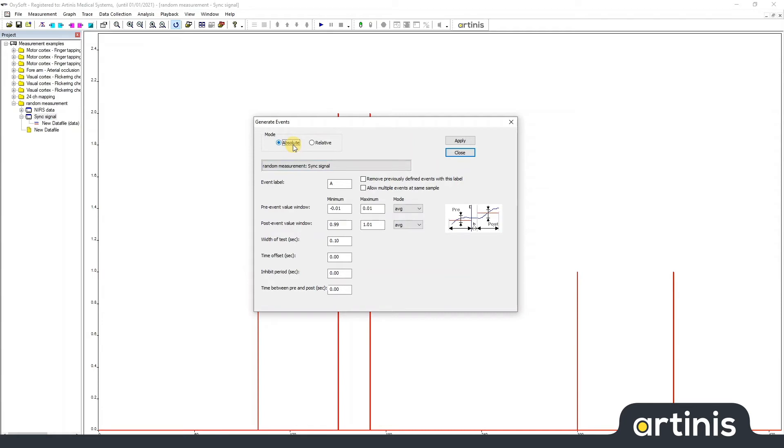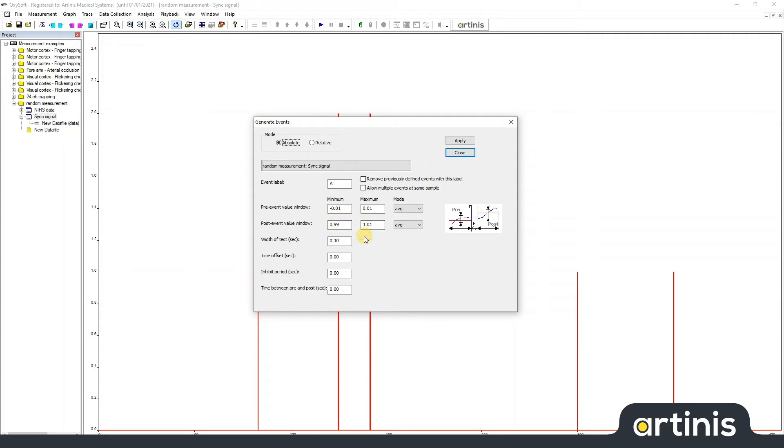First I want to detect changes from a zero value to one value. So here I need to fill in a range where this pre-value needs to be in, and a range after the event. Now I know the value here is exactly one and the resting piece is exactly zero, so I can give a short range. The same for the width of the test because I know it's one big step to one.